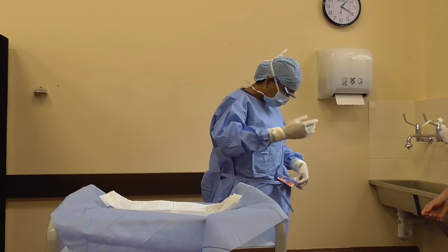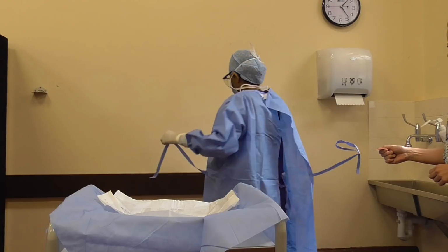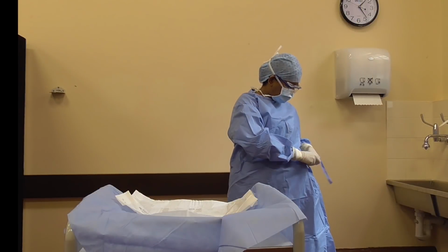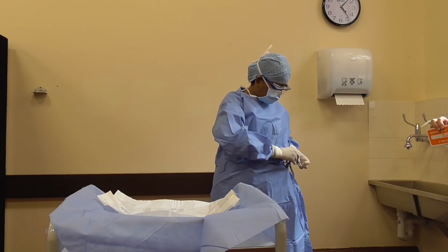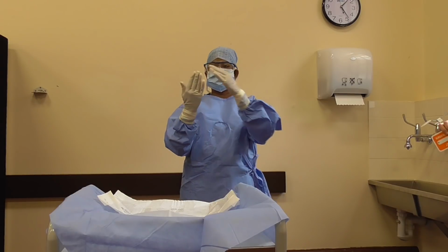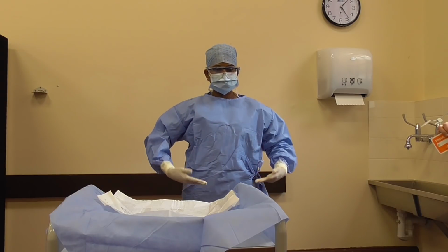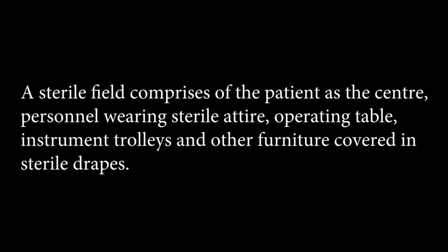To tie the front of the gown, pass the person the tag and turn to your left in an anti-clockwise direction. Grab the second string from the person and do not touch the tag. Now tie the strings. Note that your sterile zones are from the tips of the fingers to the elbows and from the chest to the waist. This is the stance that you must now take in theatre.